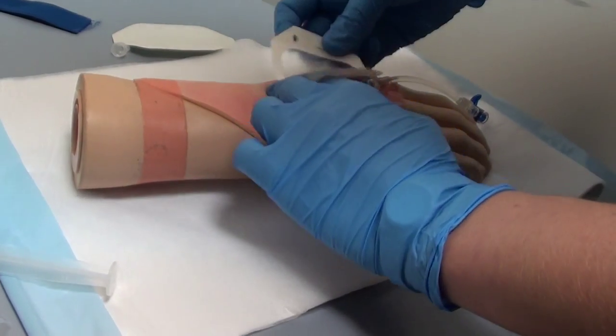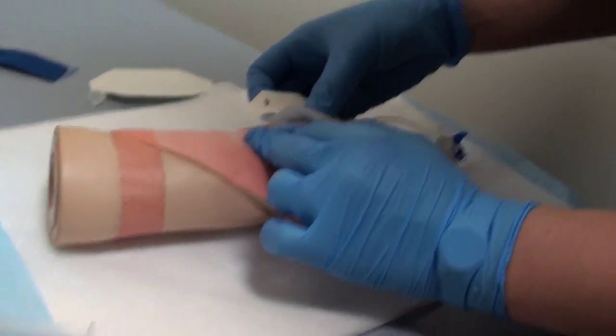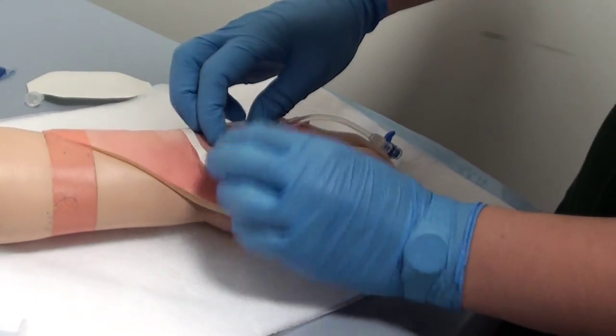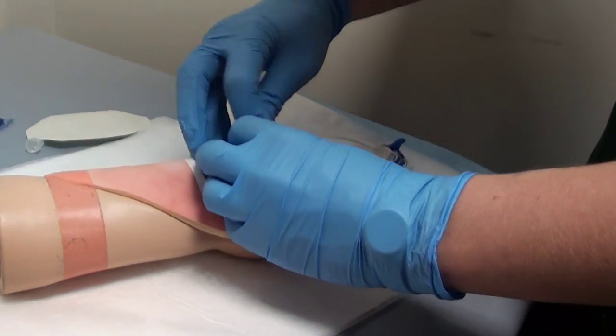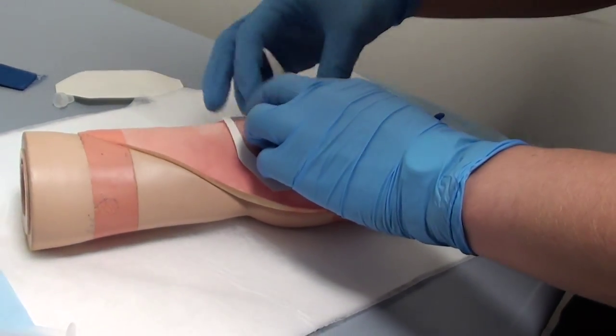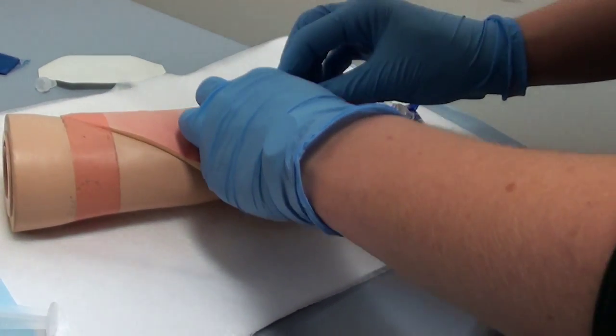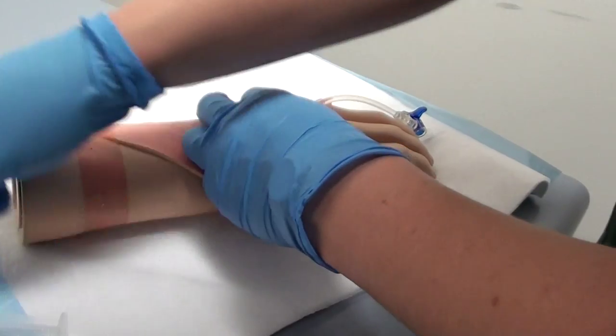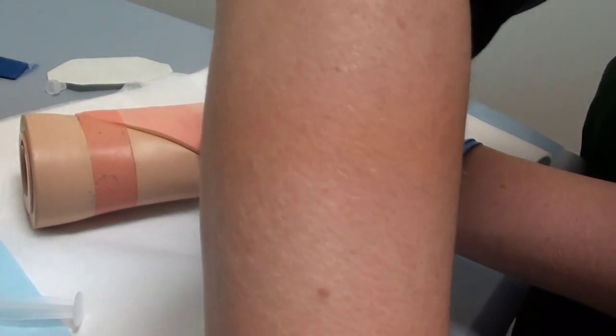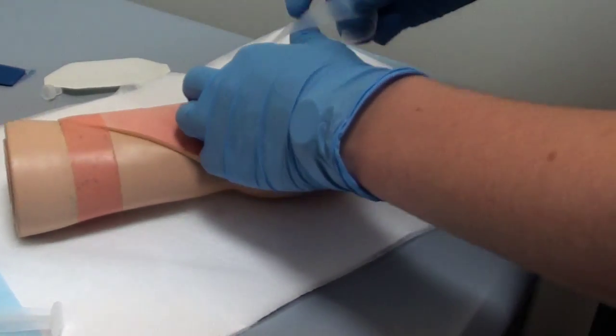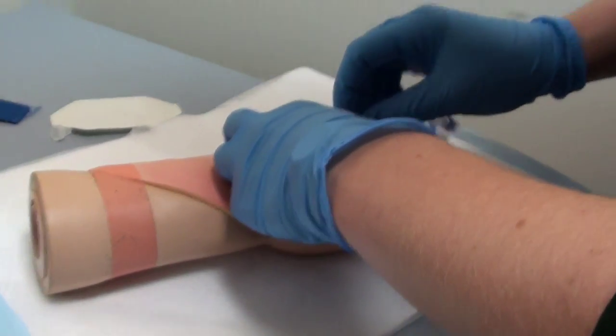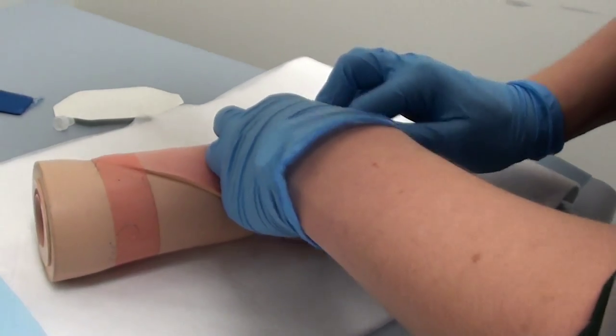I feel a couple issues with it adhering because this dummy's skin is a bit moist. But I've got tape as well. So that's my proof of concept tape here. I'll just see where it is.